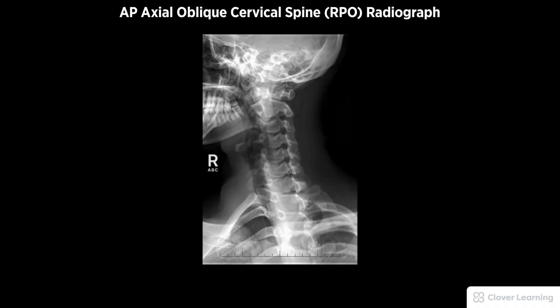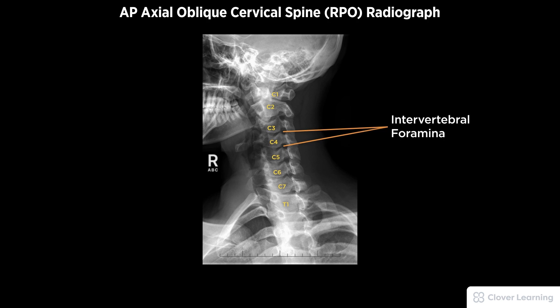A diagnostic AP axial cervical spine right posterior oblique RPO radiograph must be free of motion and have a 45 degree rotation. Demonstrated anatomy to include seven cervical vertebrae and the first thoracic vertebrae, the open intervertebral foramina furthest from the image receptor, with proper visualization of soft tissue and bony detail.